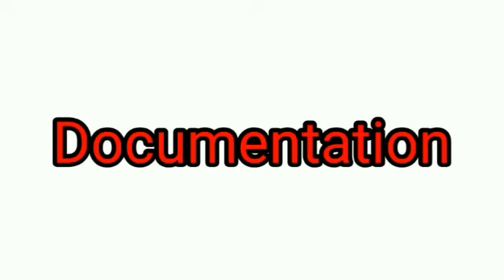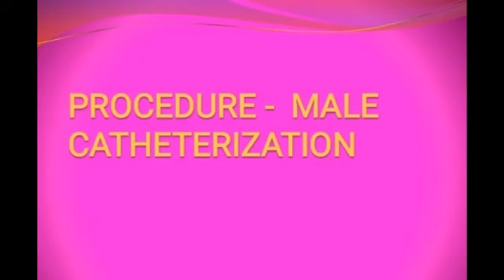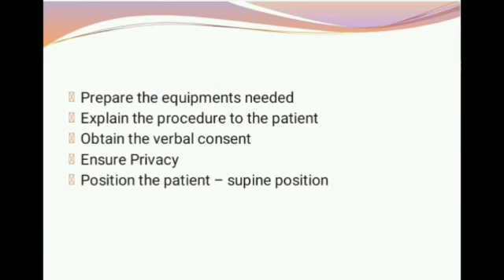In documentation, we have to mention the time and date of insertion of catheter, amount, odor, color of urine, size of catheter used, how much sterile water injected to inflate the balloon, and the name and signature of the person performing the procedure. Now, procedure for male catheterization.